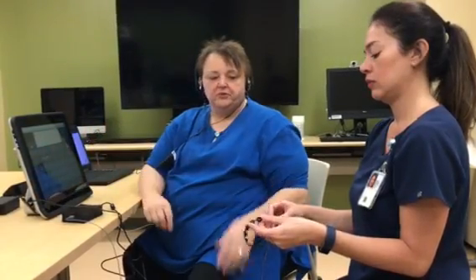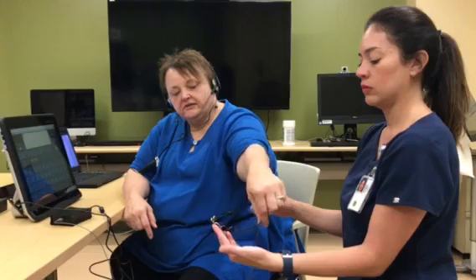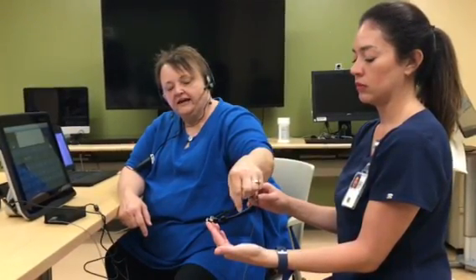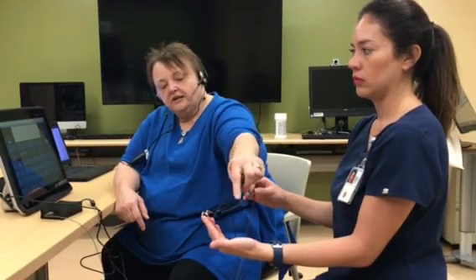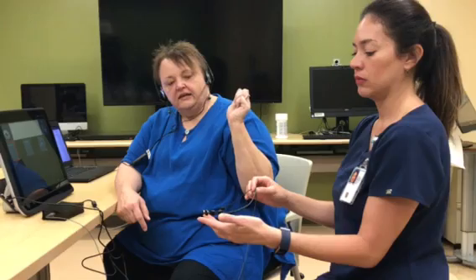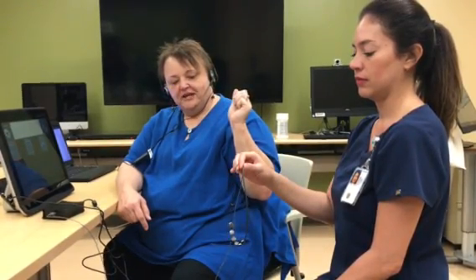Then Talena, we want to put on the headband with the wire side here. This side is elastic so that you can adjust it to people's heads. You want the wire side to be on the left side of the patient's head.